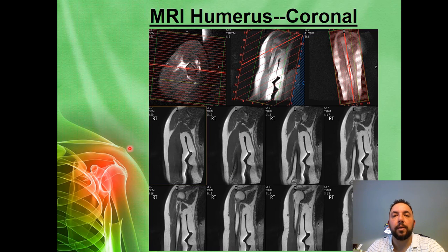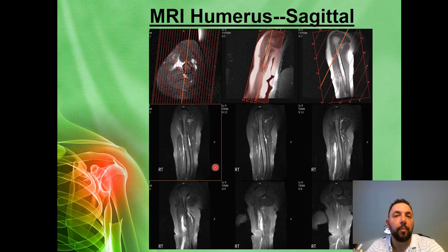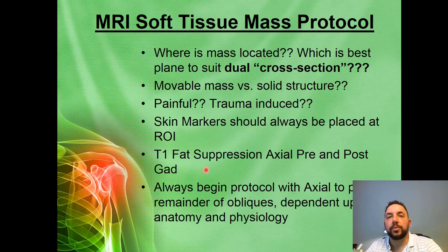Coronal images, you want to acquire, again, a much larger field of view. Utilize medial pre-saturation slabs or bands whenever possible to, again, minimize any respiratory motion artifact. Utilize a head to foot phase direction for the minimization of artifacts if at all possible. On a sagittal application, you can utilize an AP phase direction and significantly reduce your scan time through the utilization of a rectangular field of view option. Now this will lessen the phase steps in the anterior to posterior direction, which will save you precious scan time. And again, in our sagittal approach, you can see pertinent pathology as we run through that.